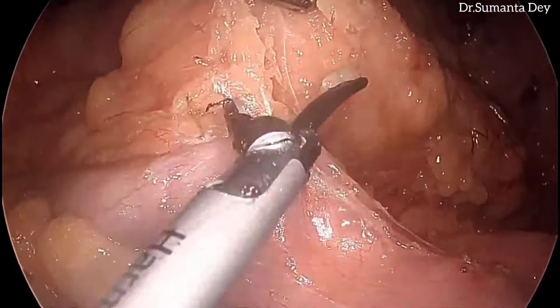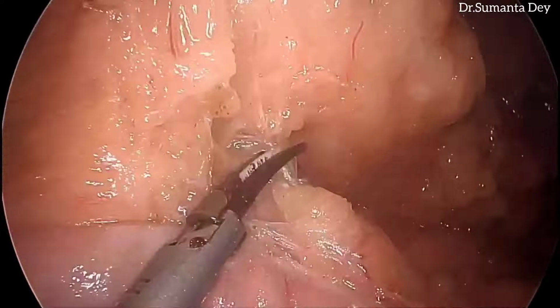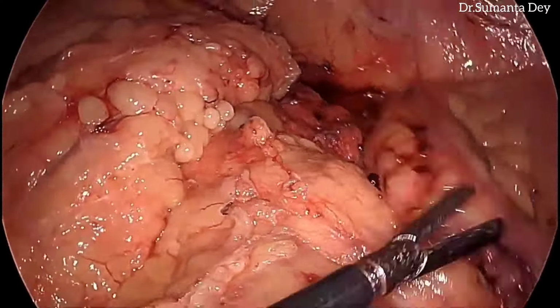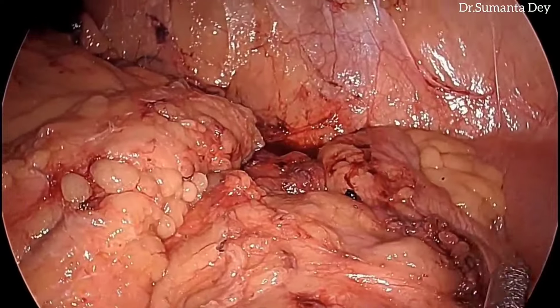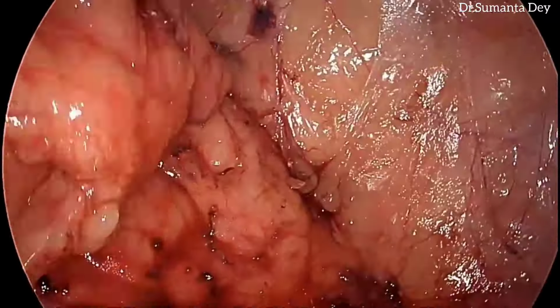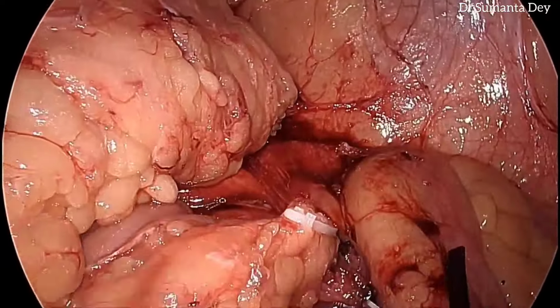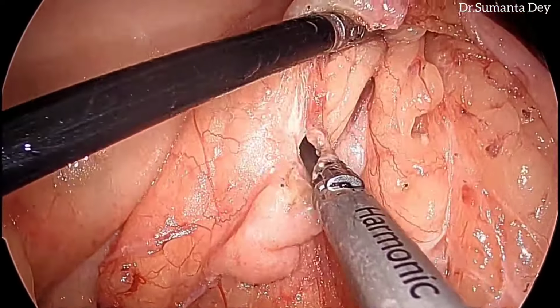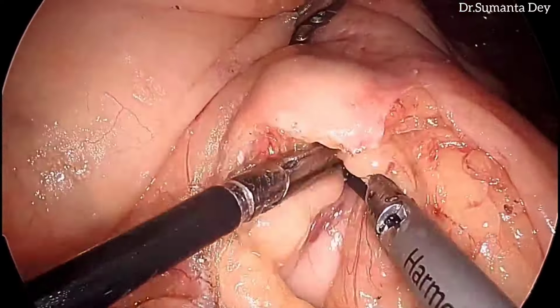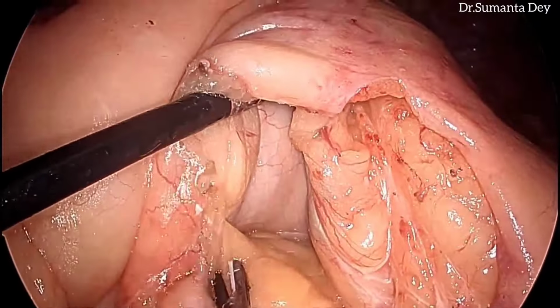My idea is to get a 5 centimeter proximal and 5 centimeter distal margin, along with complete mesocolic excision and central vascular ligation. Here in this case, as this is a distal transverse colonic growth close to the splenic flexure, I will be dividing the left branch of the middle colic artery and the left colic vein at the root. So further mobilization is being done at the root of the mesocolon.